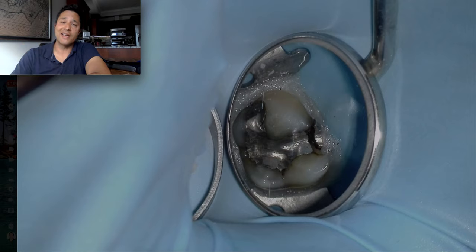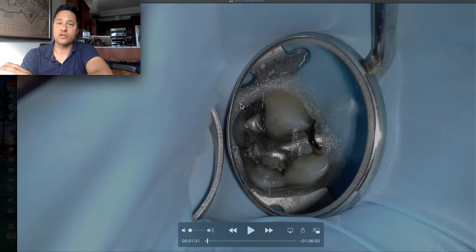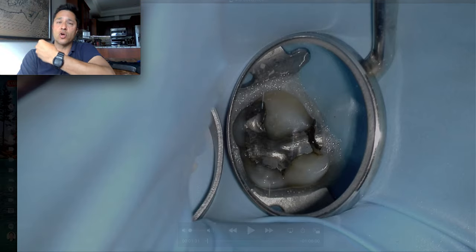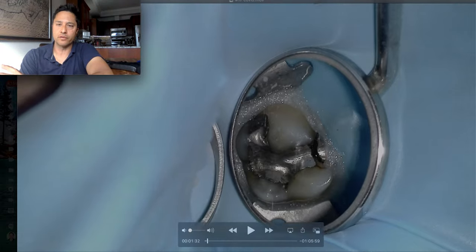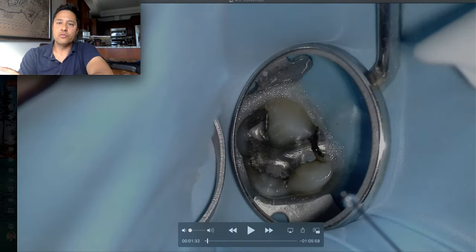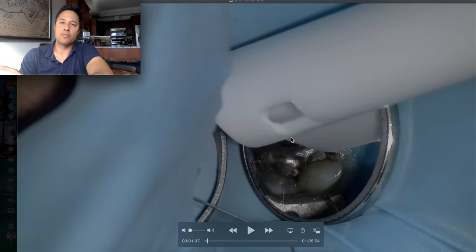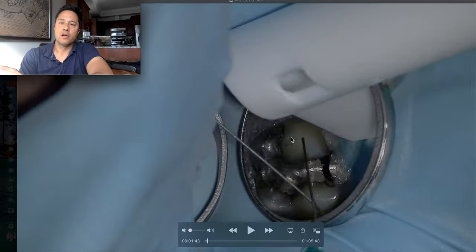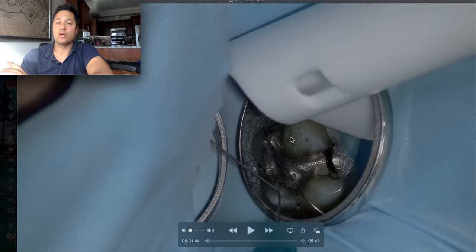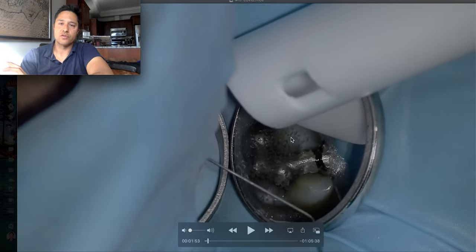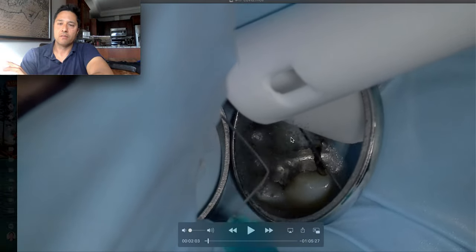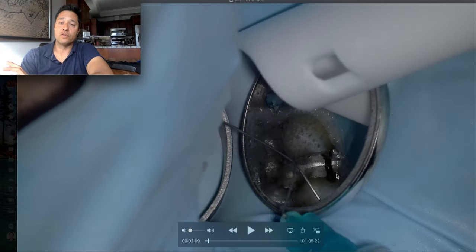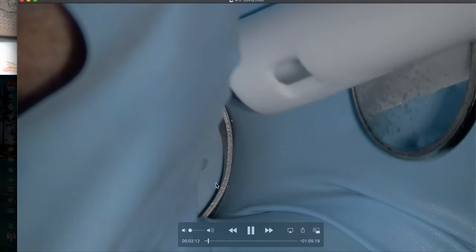We use our secondary seal, which is this opal dam. If you haven't used it yet, I recommend you getting it. It reduces the amount of saliva coming into the operating field and it reduces the probability of having your caustic irrigants going into the patient's mouth. Super useful. What I do in this case, we rinsed the operating field with some hypochlorite. The patient does do a pre-procedural coronavirus hydrogen peroxide rinse. And this is just another added safety benefit here. But you'll see in a second, once we remove this fractured amalgam, it all kind of goes to heck.